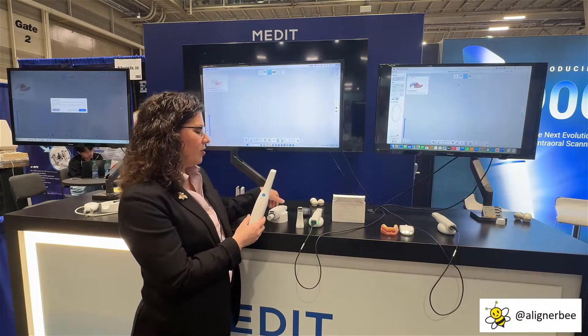Let's take a look first at the previous i700. As we can see here, it is a fairly large scanner, and it had buttons to turn it on and off. This came in a wired version and a wireless version.